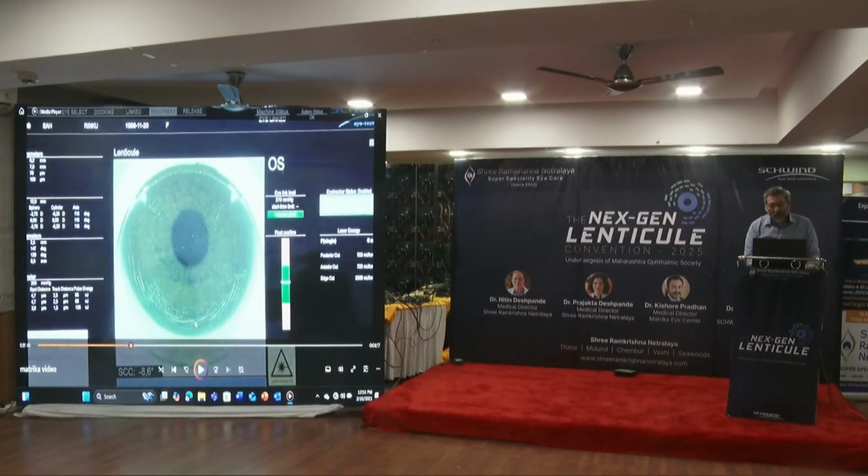So you see a lot of these over here. These small things are all micro sponge particles. So they can give you small black spots. But if you look at it, it was not docked. So when you were there, Dr. Nitin, I would have redocked and redocked and redocked to get the two crosses aligned on top of it, right? Remember, we were taking so much time because before we didn't have eye tracking.